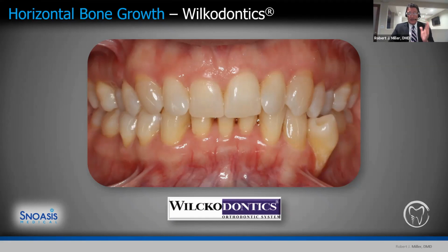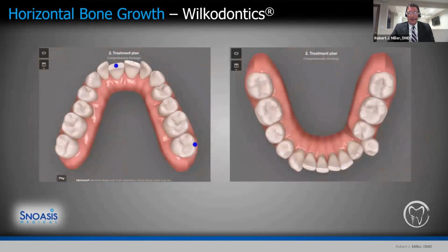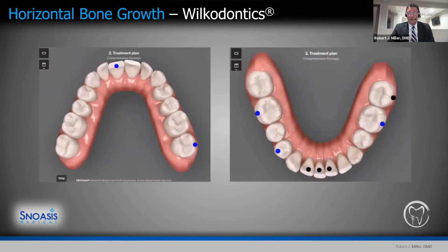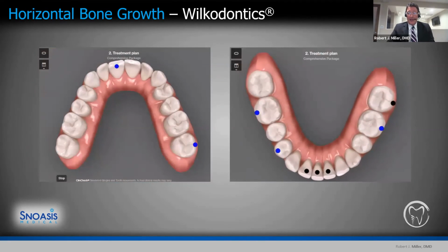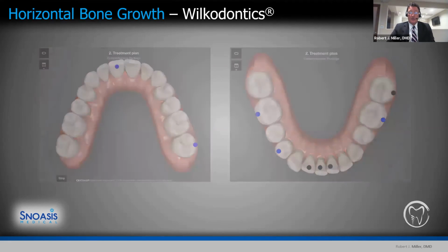So this case here, this is a woman who presented to the orthodontist, and you can see that tooth number 21 was actually outside of the arch. At this point it had very little, if any, bone, clearly not a salvageable situation. And what the orthodontist was hoping to achieve was basically removing tooth number 21 using Invisalign to realign these teeth and also increase the dimensions of the ridge.